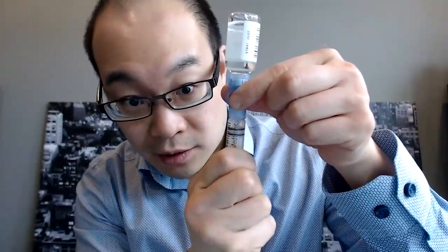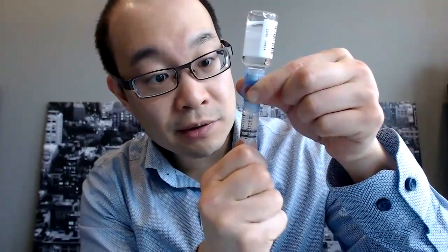And how this guy works is that there's a needle here, and this just punctures in like so. Okay. Now there's a stopper here. And what I'm going to do is I'm just going to slowly fill that up with insulin. So you can see that I'm slowly filling it up with insulin. Probably should have put some air in here to make it easier. And you can see there's a mark here. I'm going to fill that up to the 1.8 milliliter range.